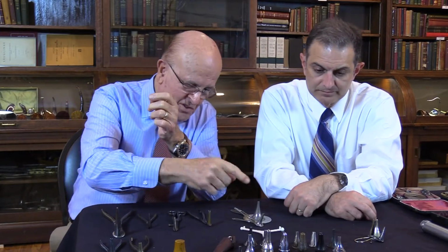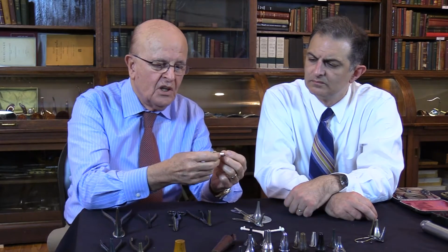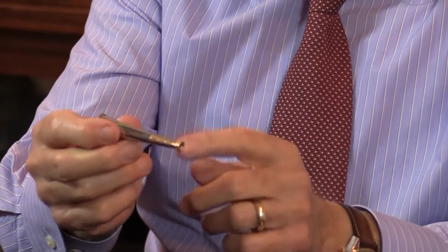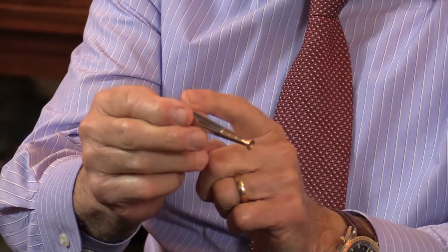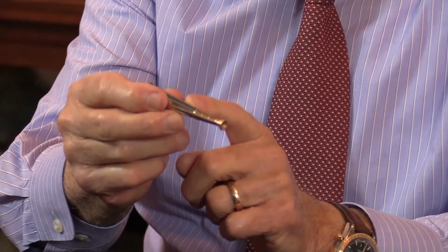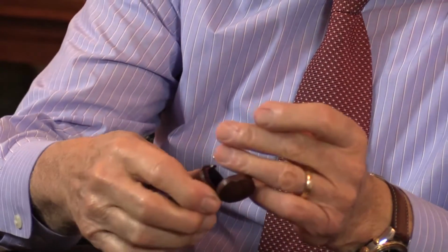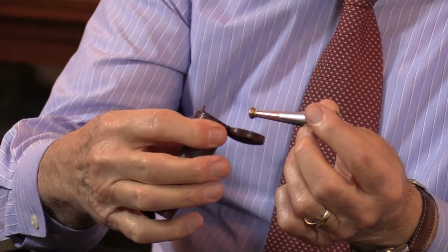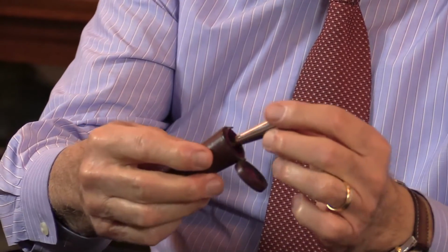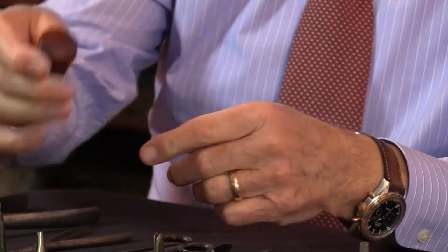Well, talking about silver, here's a more expensive one. This is Deleau. It's a long one, and you wouldn't believe it. This is made of gold and platinum. That was the time when there were only a few people using ear speculum. So I think they could afford it, and that would probably impress the patient, having this. Yeah, and they put it in a beautiful case here that just snaps in.